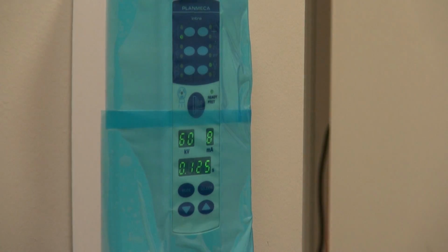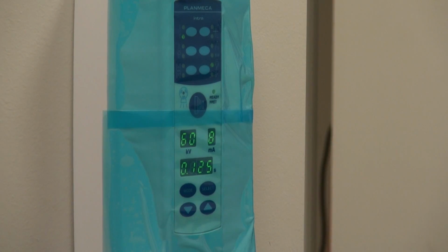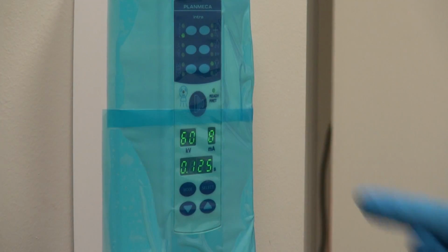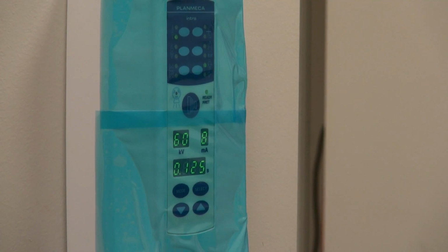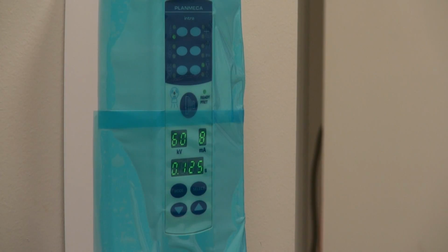You will have to recalibrate at the control panel for each posterior image, making sure that the correct setting is chosen for maxillary and mandibular arch and premolar or molar area. Always calibrate before placing the film in the patient's mouth. We want to take any difficult images in a timely fashion in order to lessen patient discomfort.